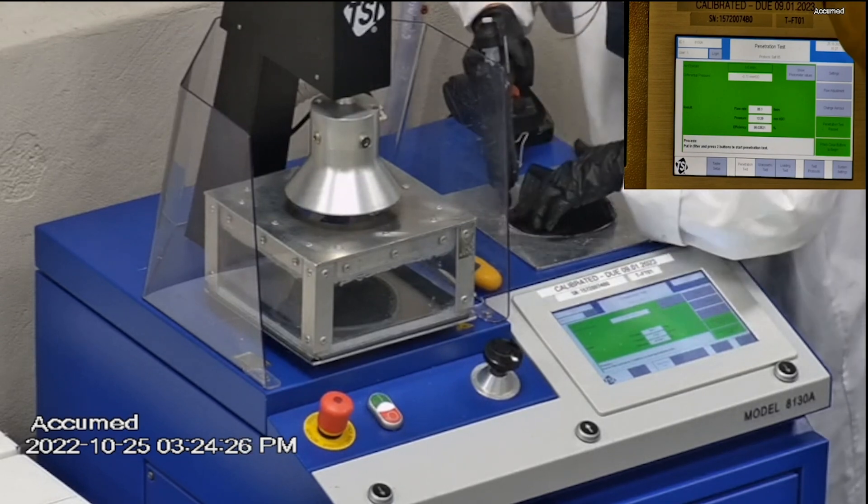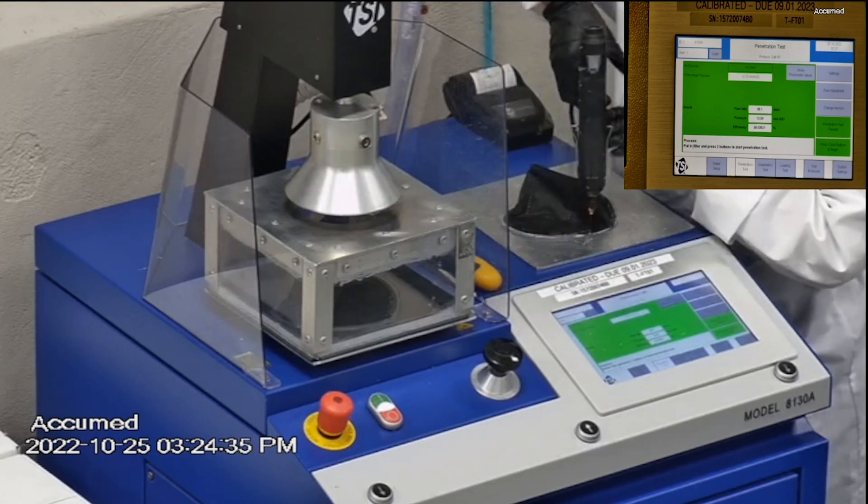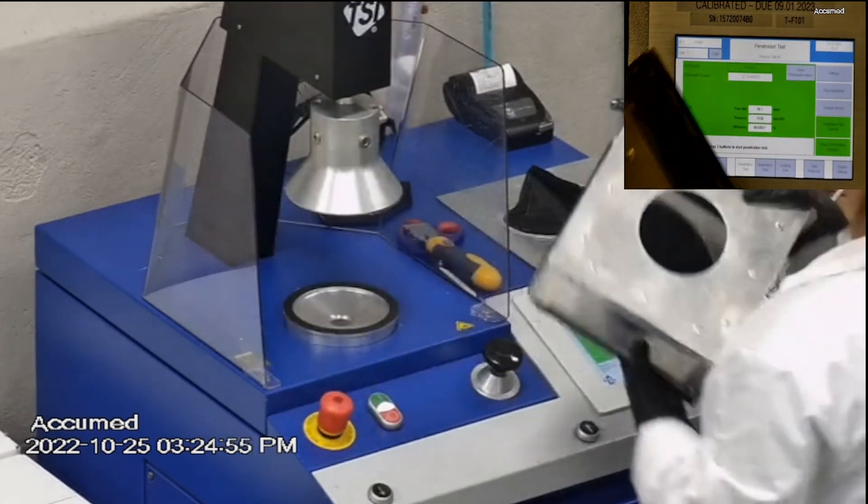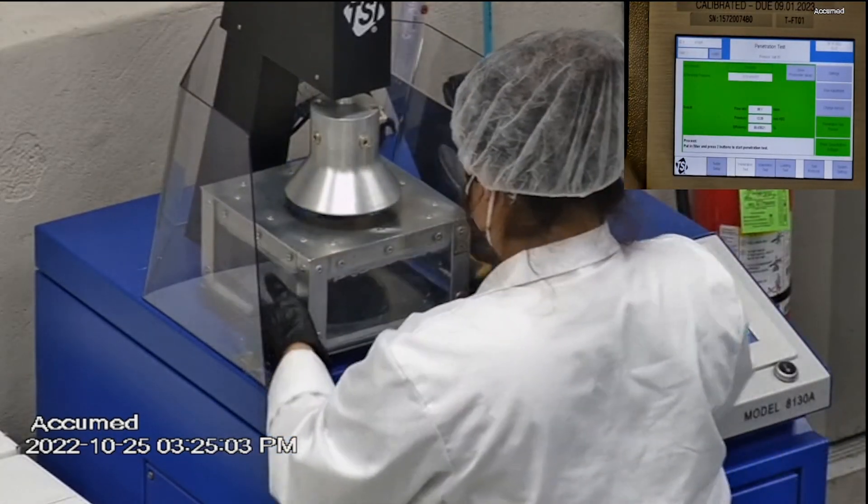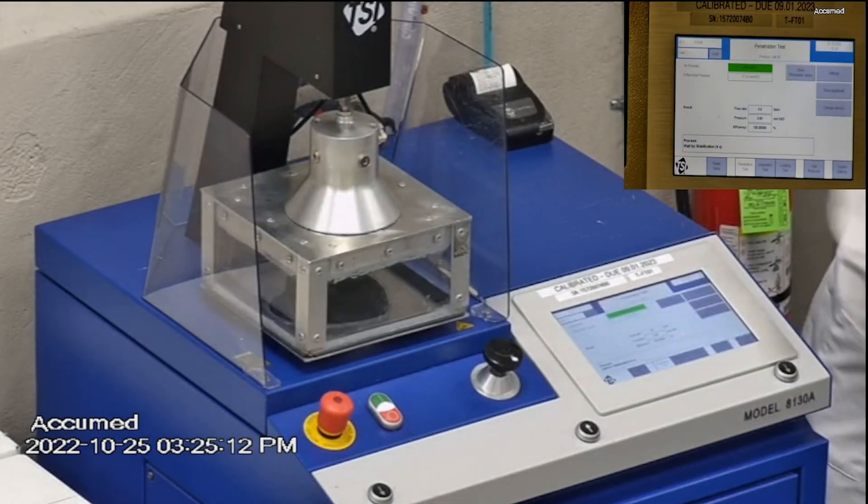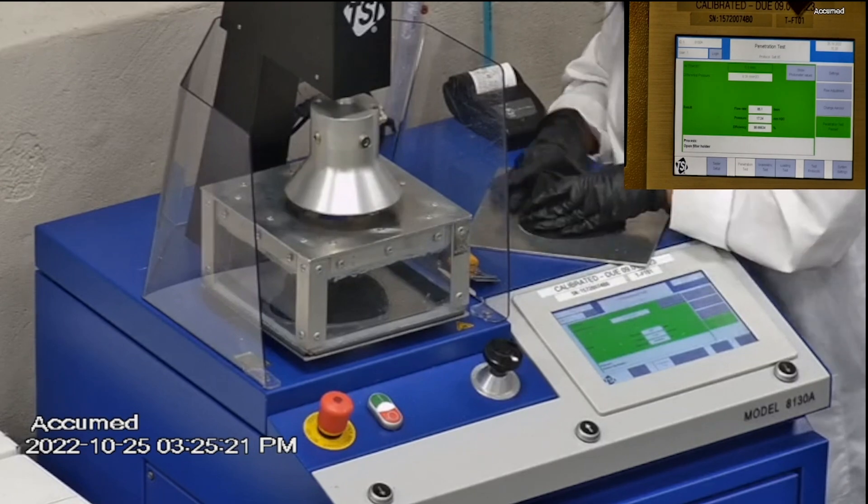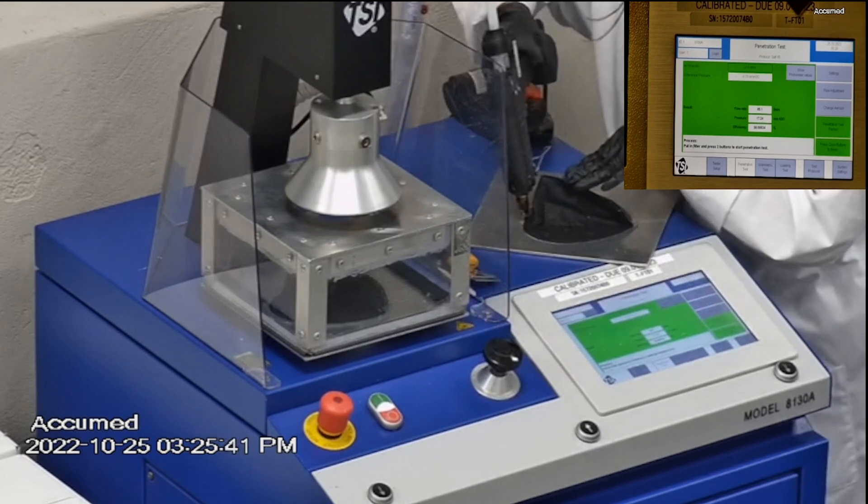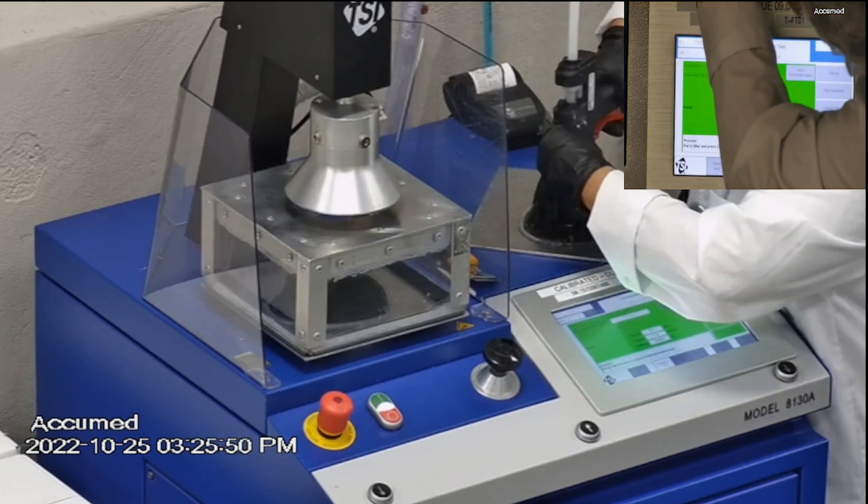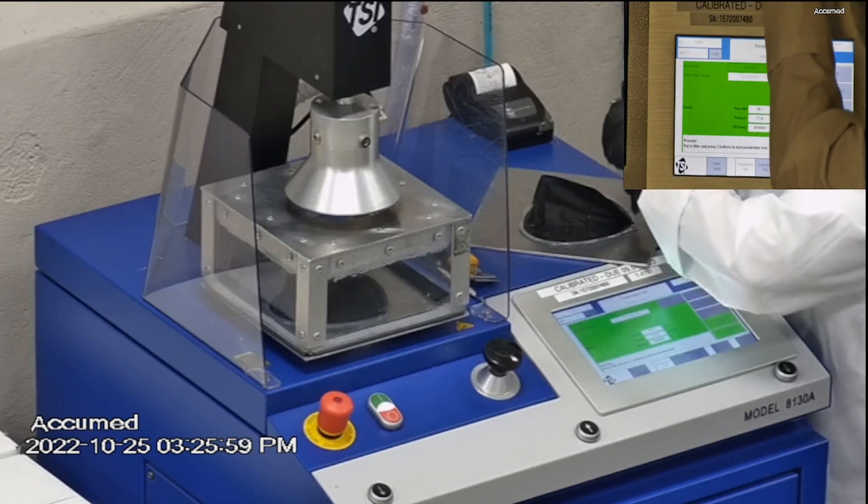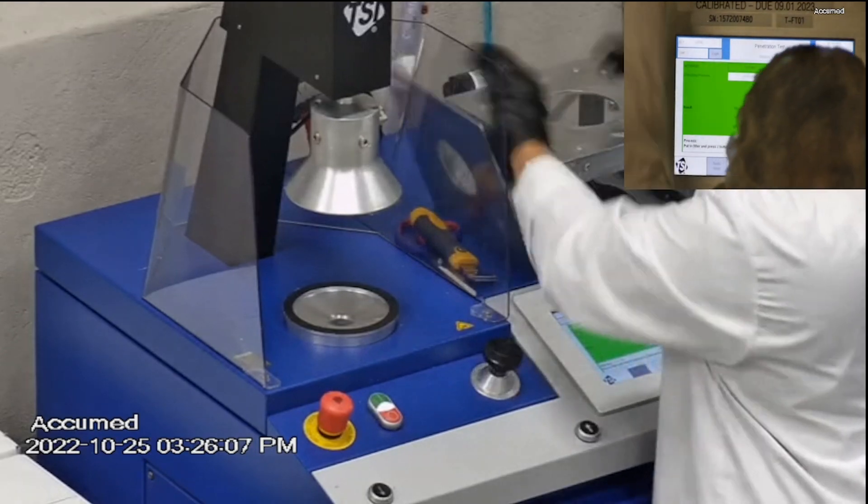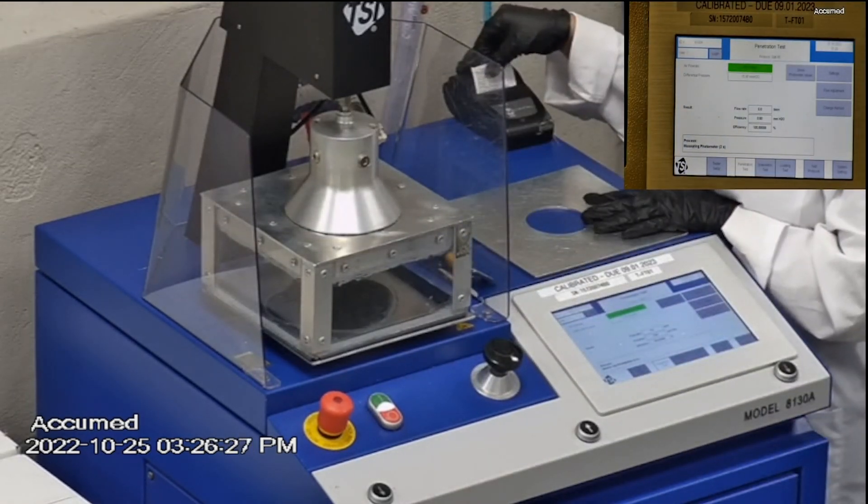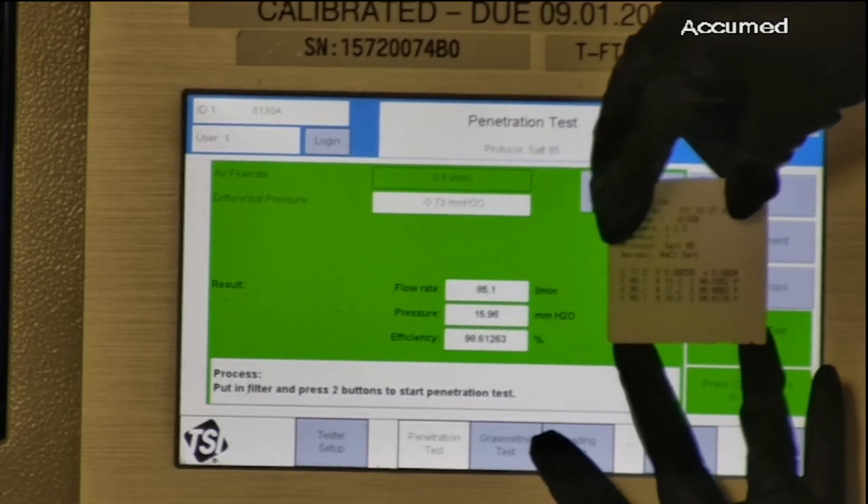The first sample tested at 98.03% with the pressure drop of 13.3 millimeters of water. The last sample tested at 98.61% with the pressure drop of 16 millimeters of water.